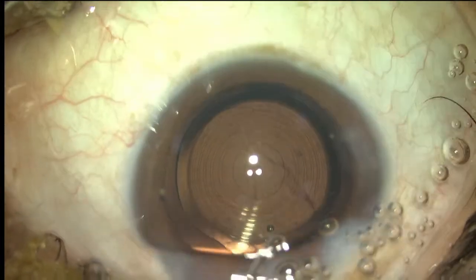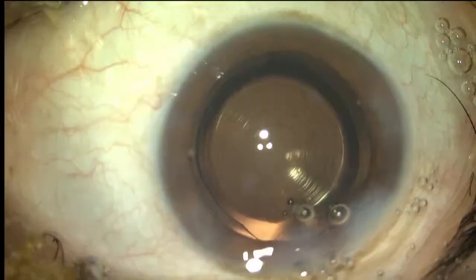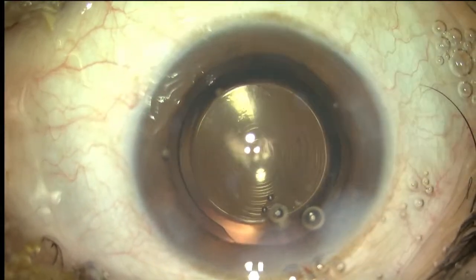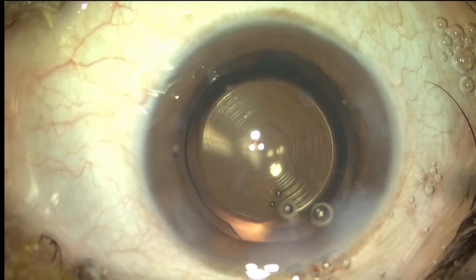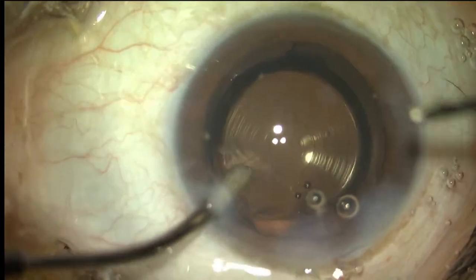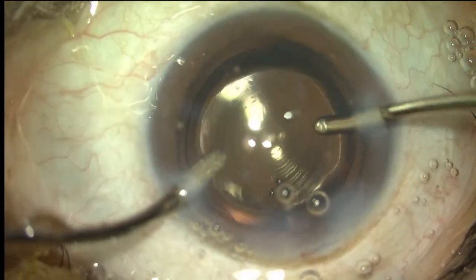So I normally seal the main wound. The main importance is the scotopic vision. It gives you much clearer scotopic vision than any other trifocal IOL. The reading vision and intermediate vision are much better.